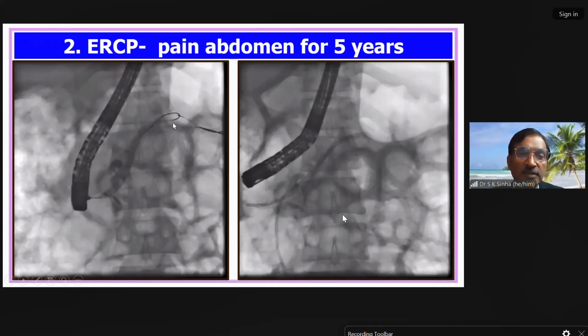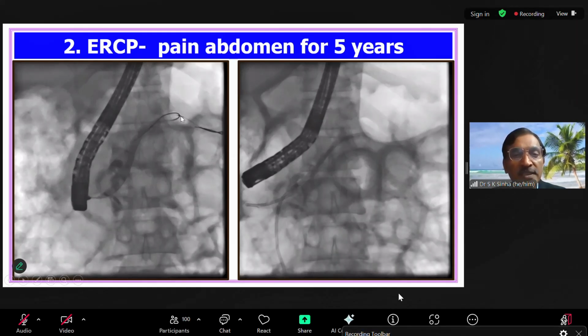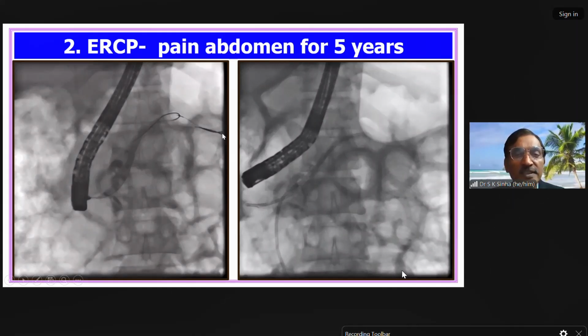So that is very important. But you see one additional point here. You can consider this also an extension of your instrument class. Here you have the tip, which is a tungsten loaded tip. This is the point that marks from where the floppy tip starts, where floppiness starts. The area ahead of this should not be used for dilatation purposes and stent, because this will provide hardly any support. So that should be taken care of.